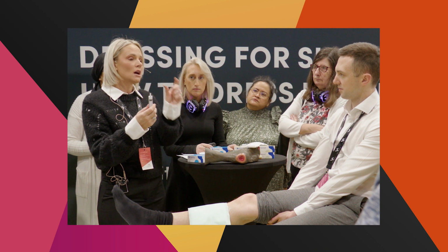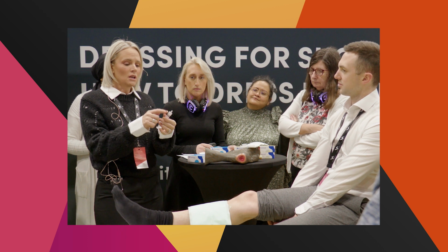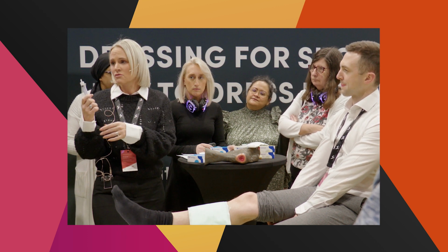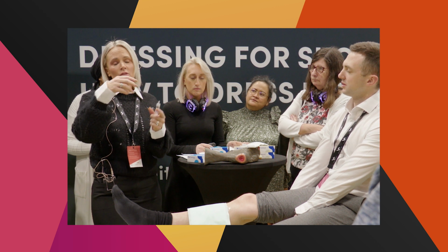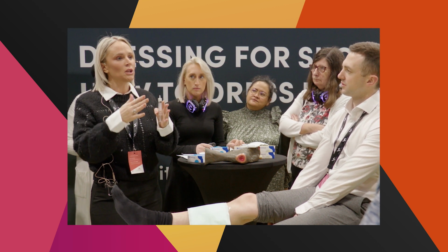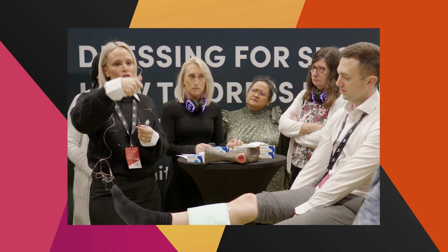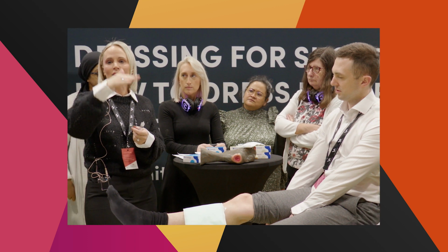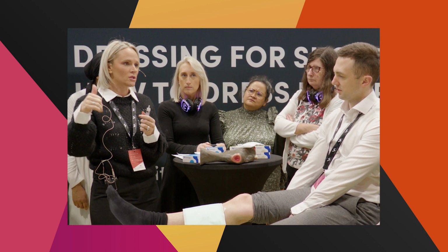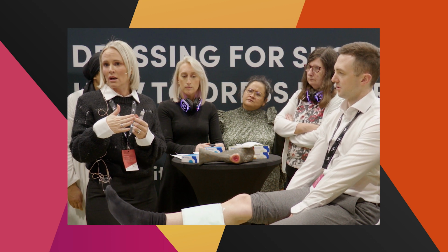And then on top of that, you just pop your secondary dressing over the top. Again, you do come with nozzles if you want them. They just screw onto the end of the Flaminol. But with the nozzles, syringes, it's really good if you want to measure volume. If you think of it like a child's balloon, you're filling it up. You can't overpack it. Once you've squirted it all into that hole, it will pop up to the top. But you can guarantee Flaminol's got into all the nooks and crannies, so there's no dead space where you've not got Flaminol covered.